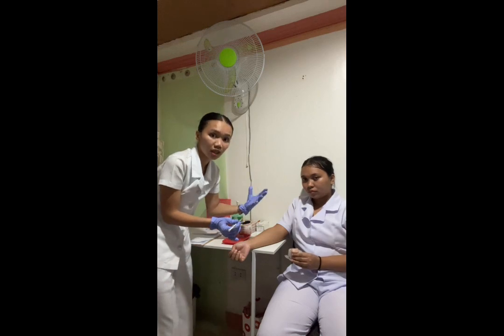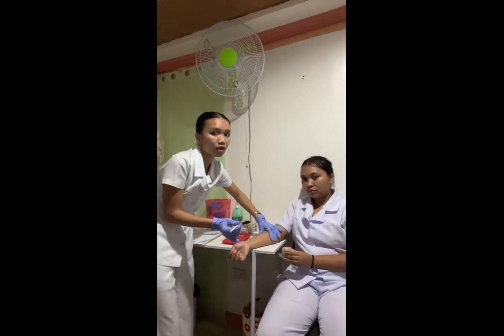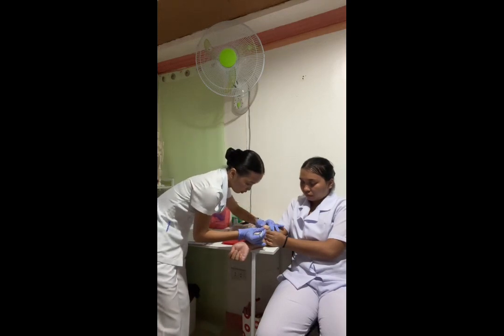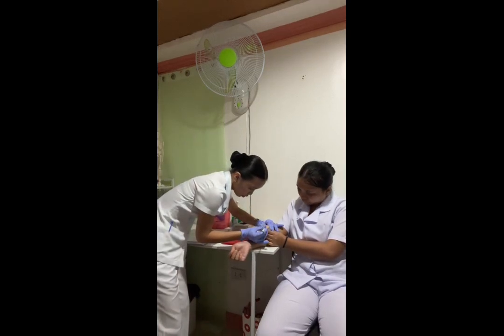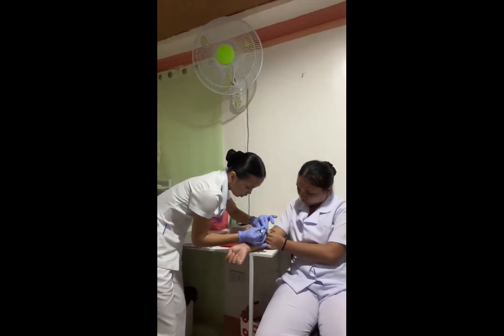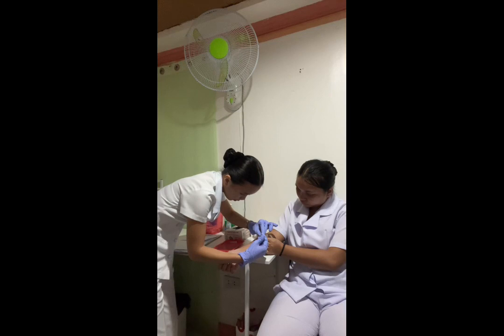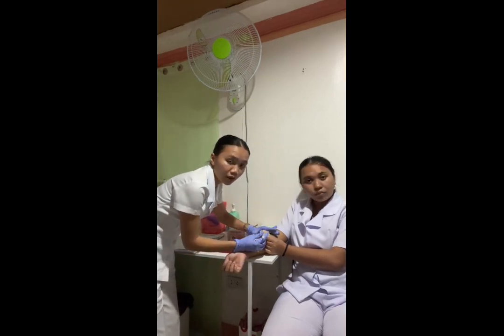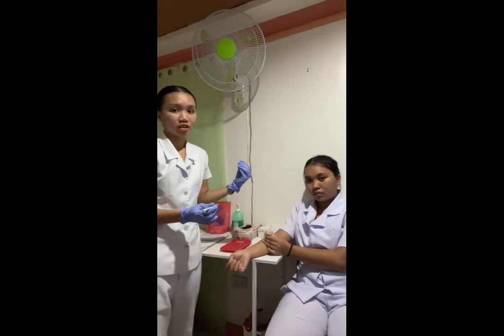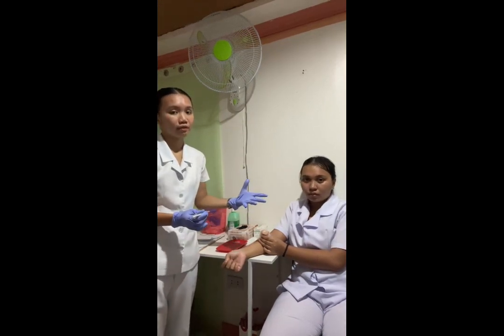And then we are going to insert the tip of the needle far enough to place the bevel through the epidermis into the dermis, and then we have to withdraw the needle afterwards. Bevel up, so in a 5 to 10 to 15 degrees, insert. Okay, so we are going to withdraw the needle quickly at the same angle at which it was inserted, because afterwards we can also apply a bandage if it is indicated.